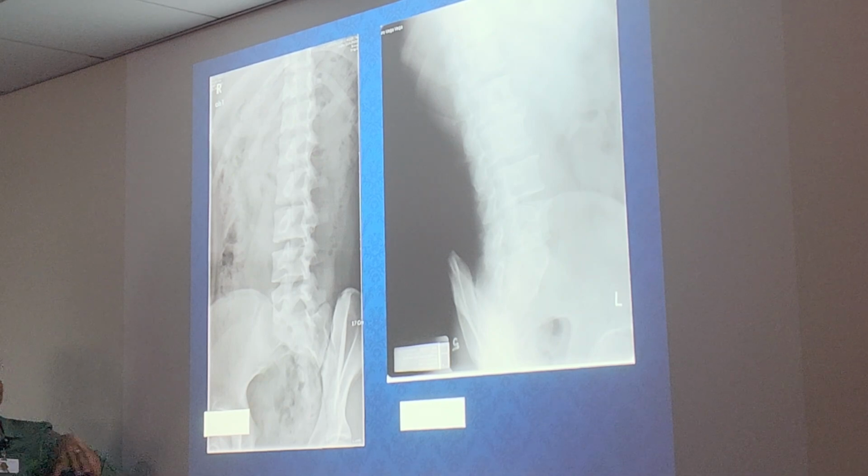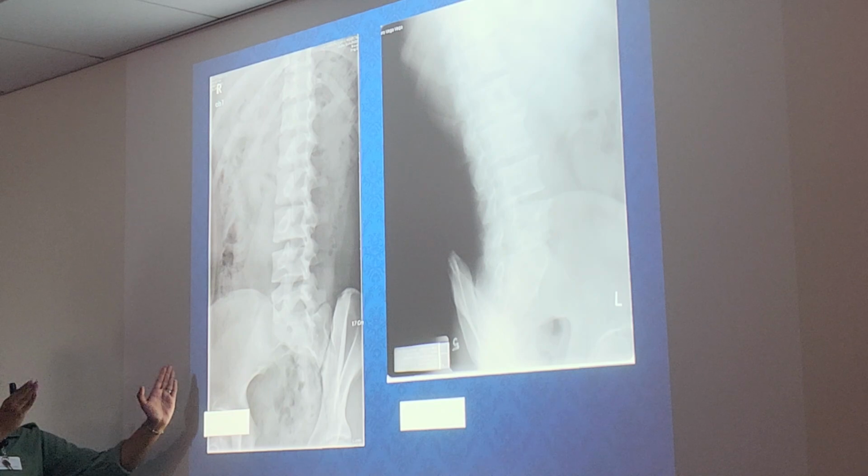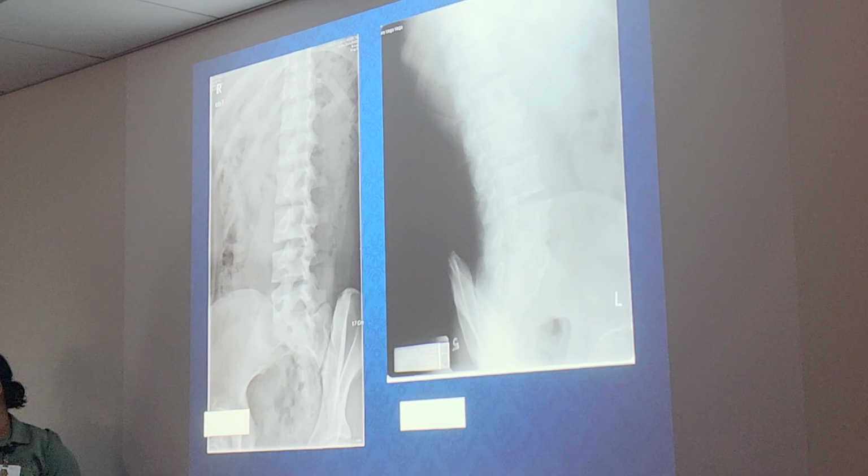Scotty dog in the hip. Take a look at this iliac crest. You see it's elongated, right? Which tells me the patient's oblique towards the IR. But how do you know if it's left or right? Because the hip will be bigger, and then you can look at your Scotty dogs. The Scotty dogs will tell you which direction.